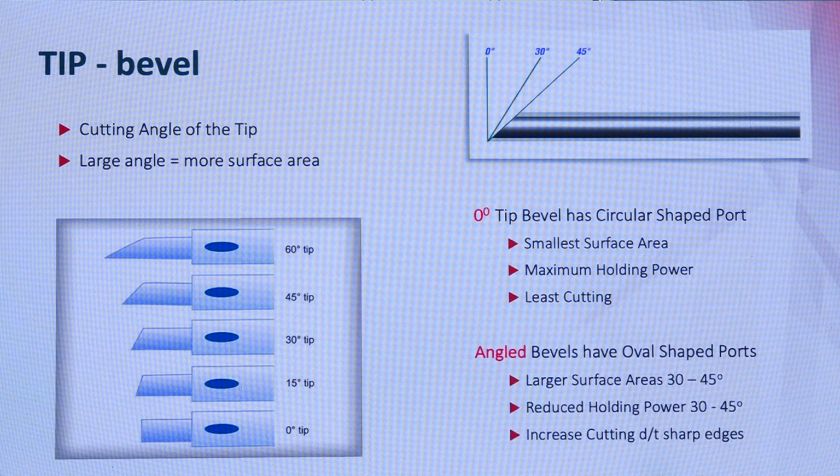So there comes the requirement of an angled, bevel surface of the tip. So we have to have a moderation of better holding as well as better cutting. So 30 to 45 degrees of bevel will give you a moderation of both, holding as well as cutting.